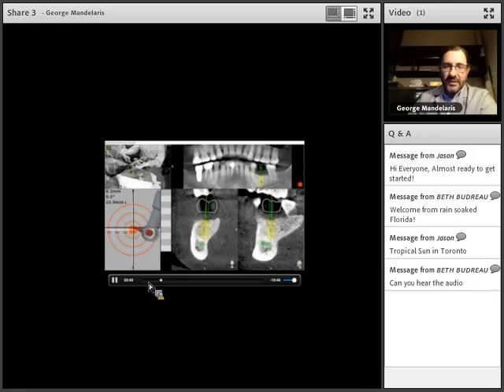So here we are from an entry point deviation. She's right on the money, and now she's just changing the entry point, or the angle deviation, so she's around 3 degrees, 2.5 degrees, 1 degree now, and she's placing an 11 millimeter implant, of which she has another 10.7 millimeters to go. So from here, it's just osteotomy site preparation, high irrigation, pumping the drill, and just watching what you're doing and being mindful and trying to make sure that we deliver the osteotomy site at the right entry point. We stay on target, entry point deviation, angle deviation, I should say, with our plan.